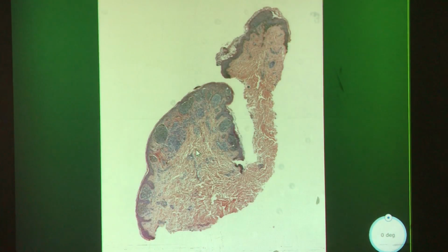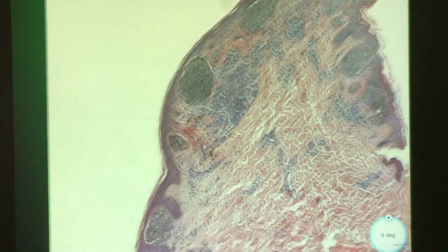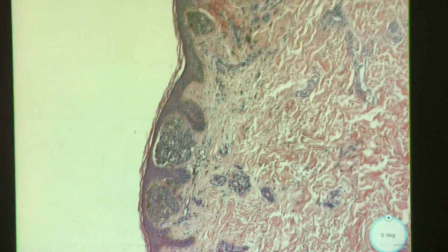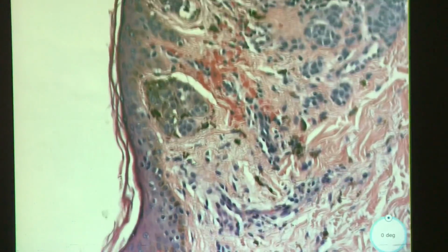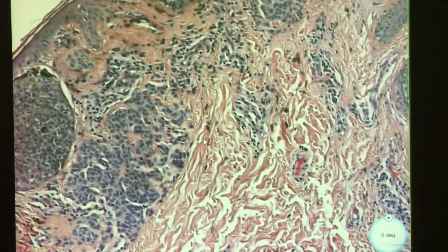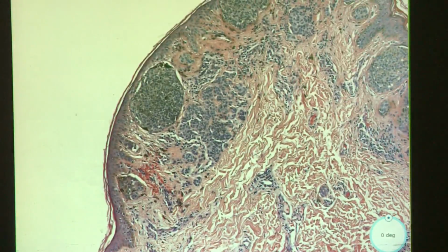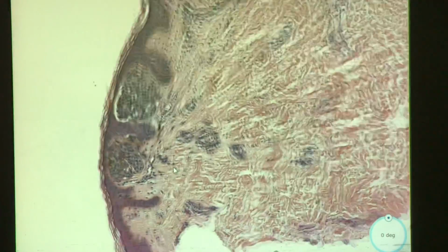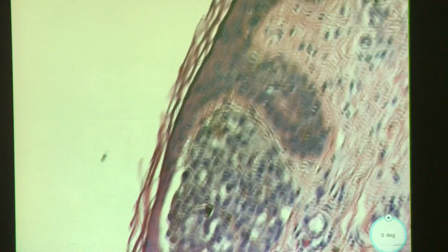Okay, so here is your slide. Okay, so again, we have some melanotic lesions here, and it looks, well, it's definitely in the dermis, and it looks like it's maturing, sort of going deeper down, kind of just gets smaller and then disappears pretty much. Ends up here in the area between the rete ridges.